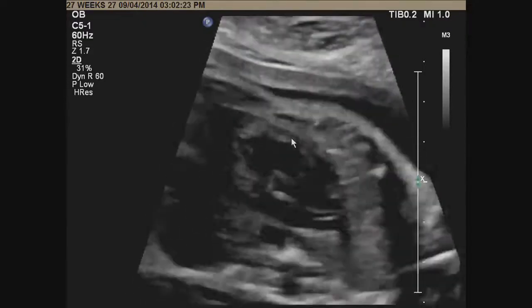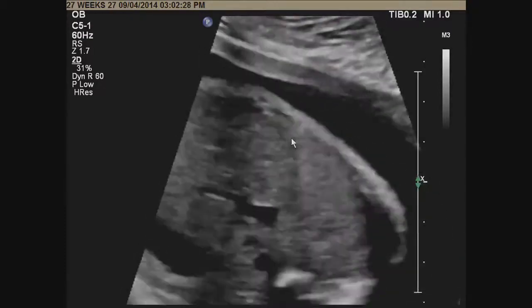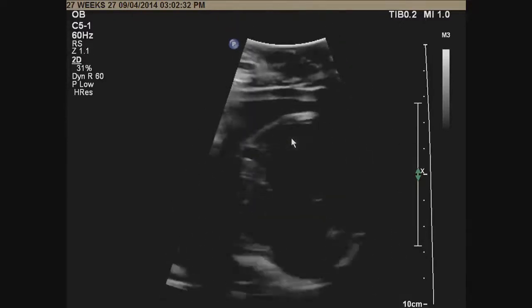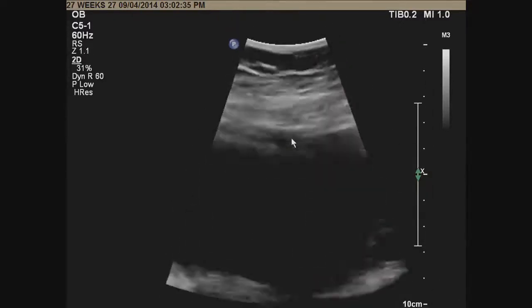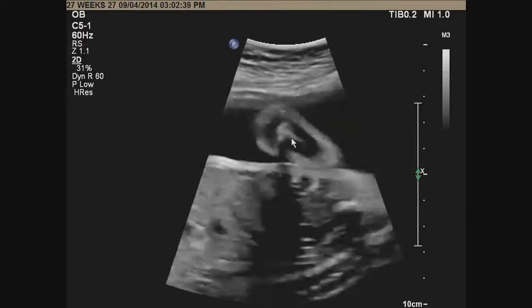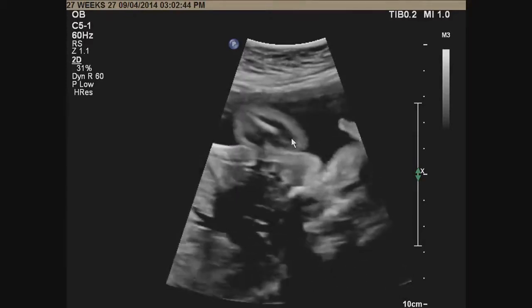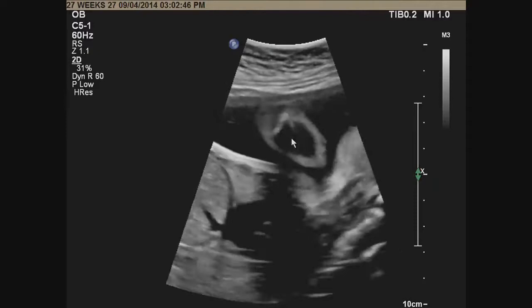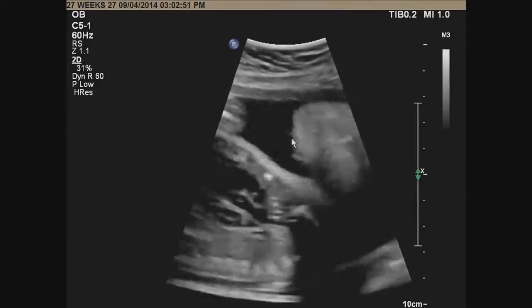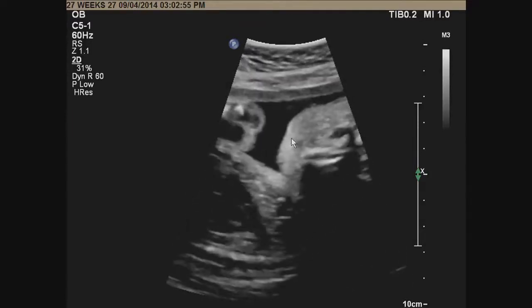So the baby is helping me now. And so now that allows me, let me magnify a little bit less, because I want to work on the arches. To see the aortic arch structure, I need to be in an almost sagittal view of the spine. So I'm going to try to come in from mom's side. And here's your aortic arch right here, even on grayscale. You see the nice curvature, nice size throughout, and you see the right pulmonary artery coming right under it. So this is the ductal arch view here.